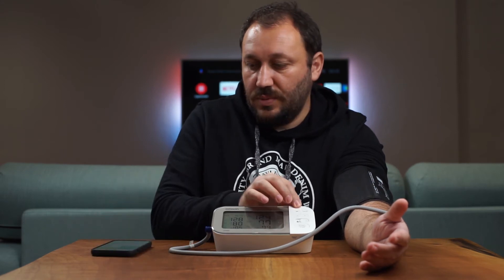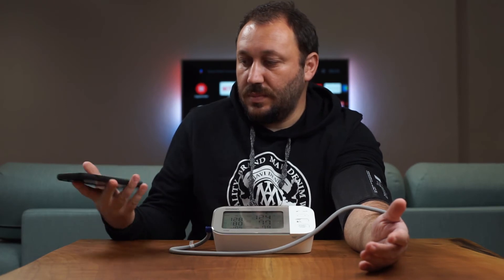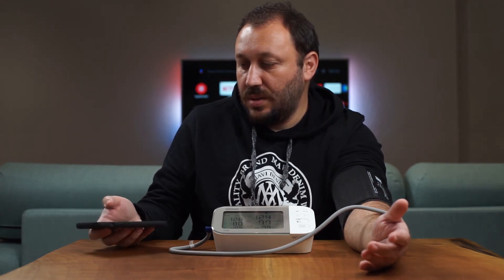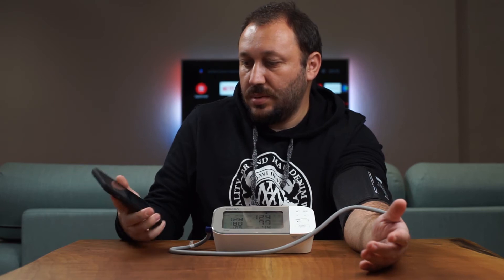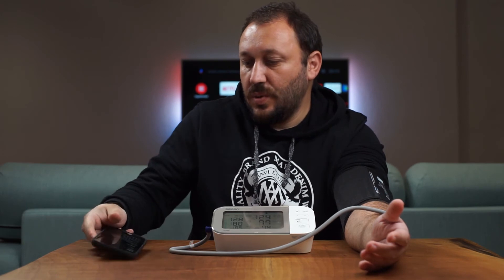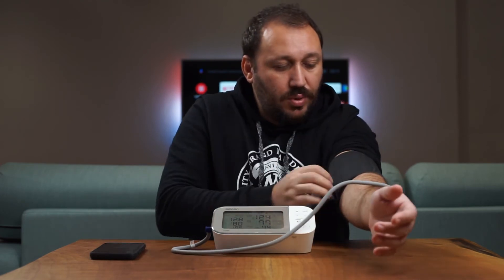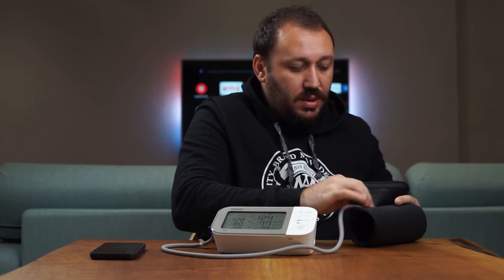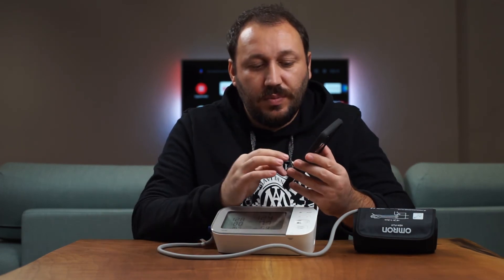I press the Bluetooth button on the device and it reads the numbers right away. They come straight into the Apple Health application automatically — which is great because otherwise you'd have to enter them manually. Omron has made this really seamless.